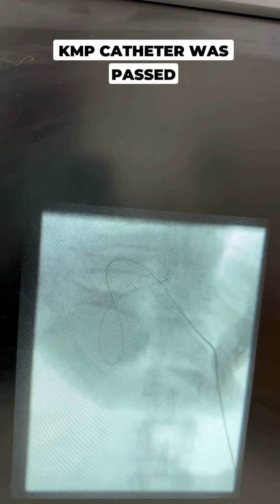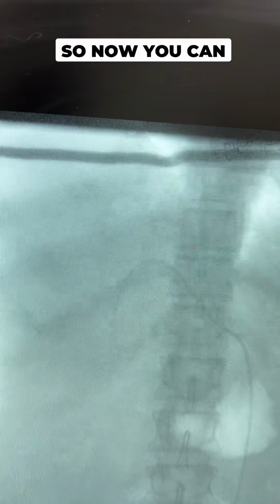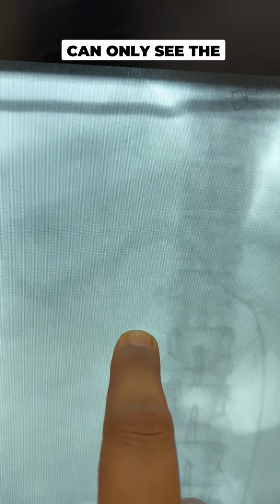You can see that this is your KMP catheter, and this KMP catheter was passed over the Termo guide wire. So this was passed till the end of the guide wire, right? Now you can see that we have removed the guide wire and you can only see the KMP.